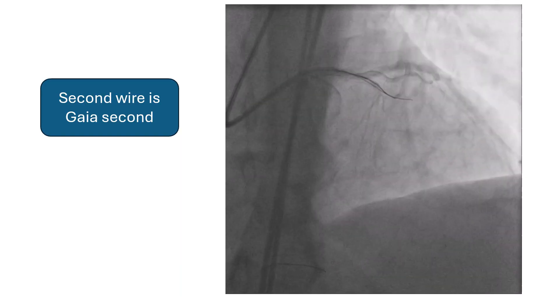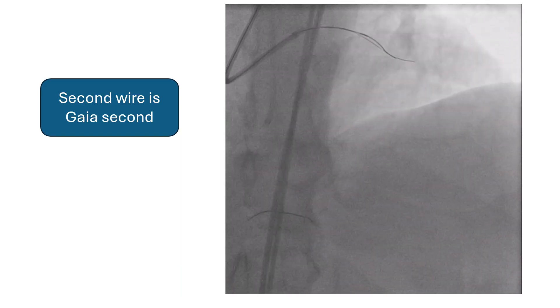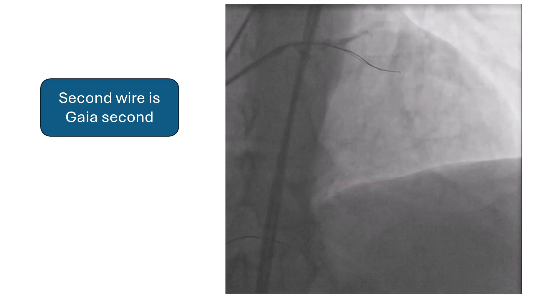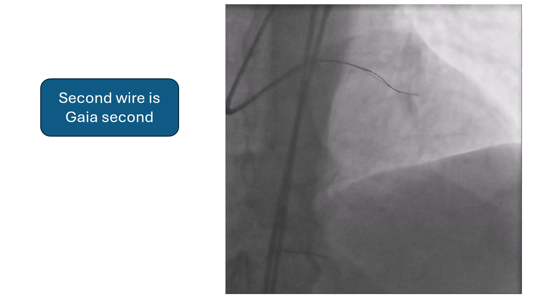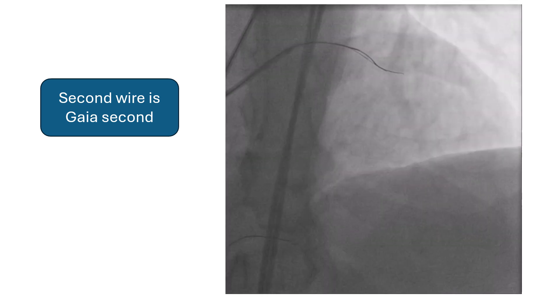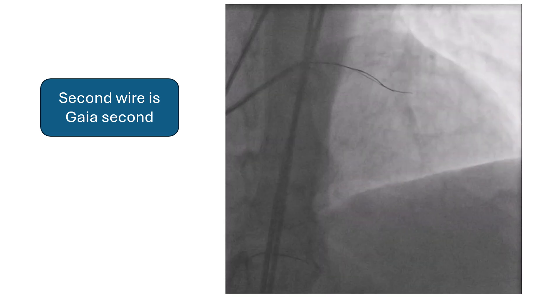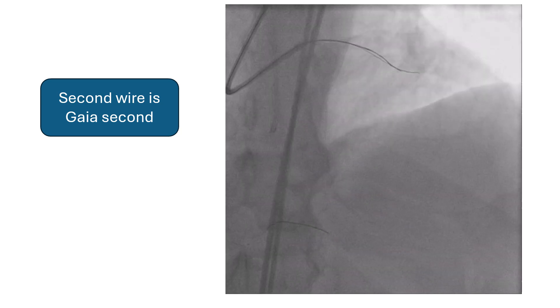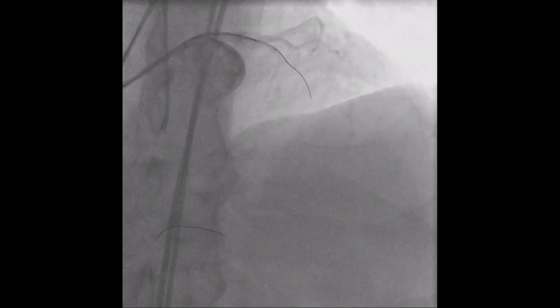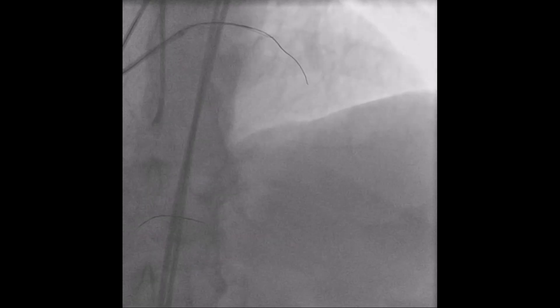So we used the parallel wire technique. The second wire was Gaia Second. It seems that it punctured the distal cap but entered into a branch. The wire was redirected to the LAD and it passed easily.